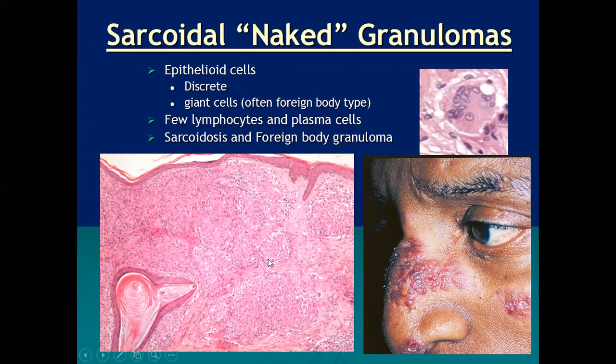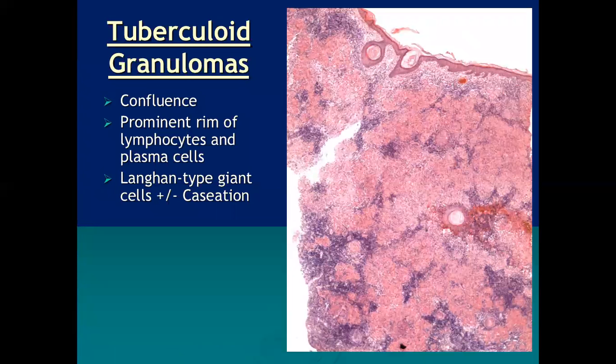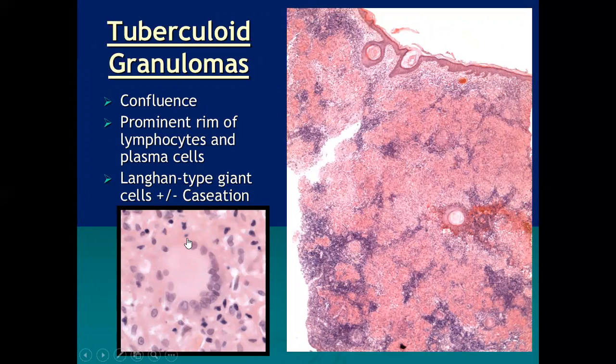The foreign body granulomas are sarcoidal in nature. So the sarcoidal granulomas are not only seen in sarcoidosis, but also in foreign body reaction. Then the second type of granulomas are the tuberculoid granulomas. Tuberculoid granulomas are again characterized by three features. The first is that the granulomas are not discrete, rather they are merging with each other. The main inflammatory cell is the Langhans type of giant cell, in which the nuclei are arranged in a horseshoe shape, and it is characterized by a dense surrounding inflammatory infiltrate, comprising lymphocytes, plasma cells, and histiocytes.